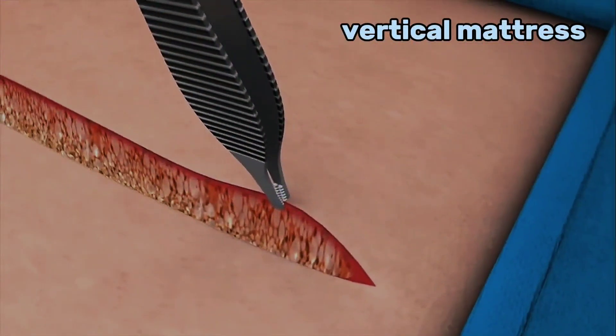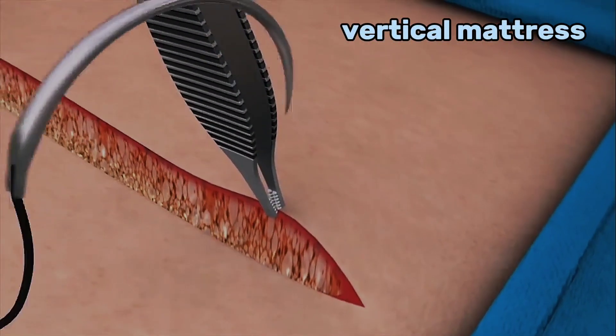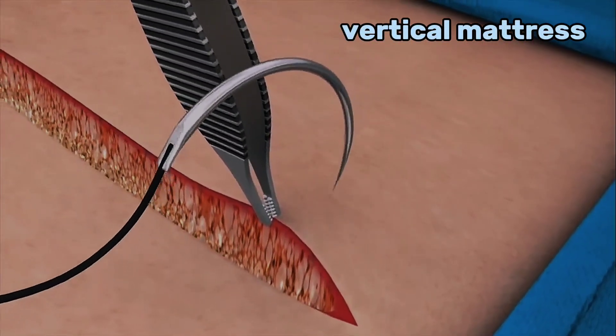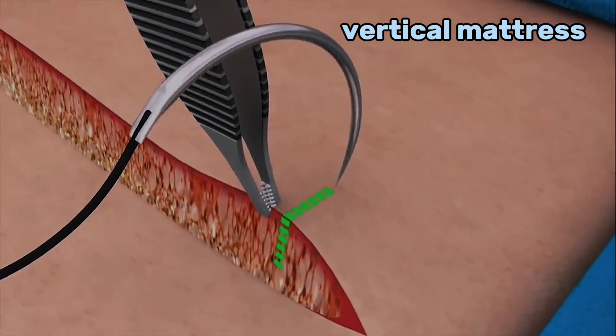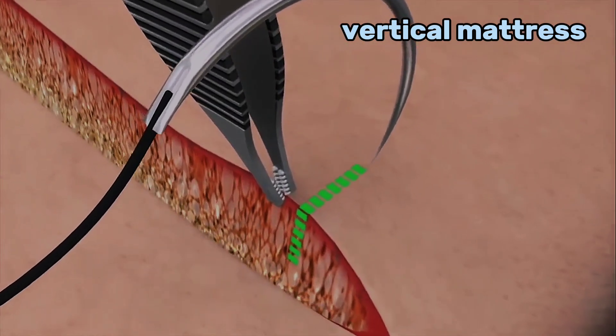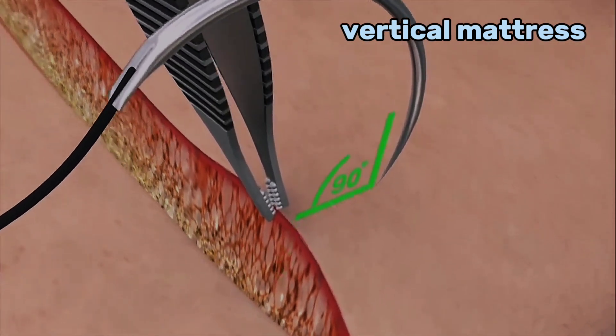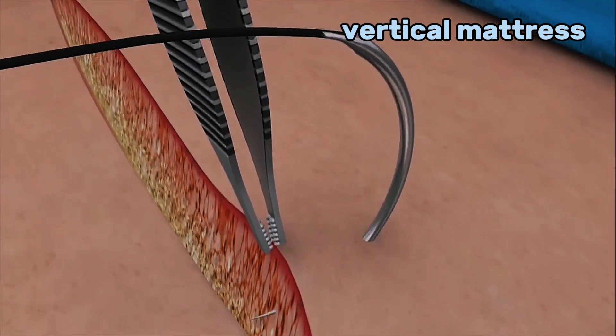Use the toothed forceps to gently lift the skin edges and hold the skin when inserting the needle. Take a slightly larger bite than normal to start the vertical mattress suture. Insert the needle with the point at 90 degrees to the skin.